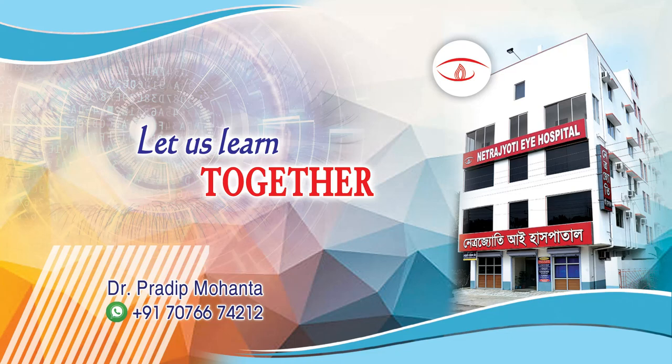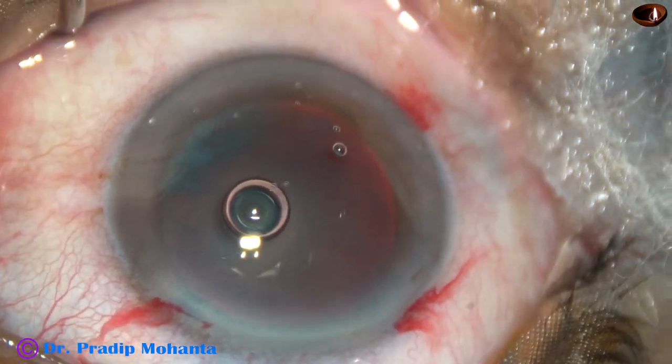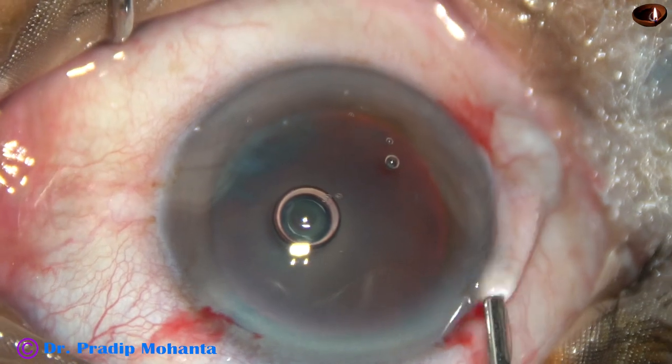Friends, welcome to my workplace at Ranaghat, West Bengal, India. In this video, we are going to see submarine chop in a cataract with grade 3 nuclear sclerosis.